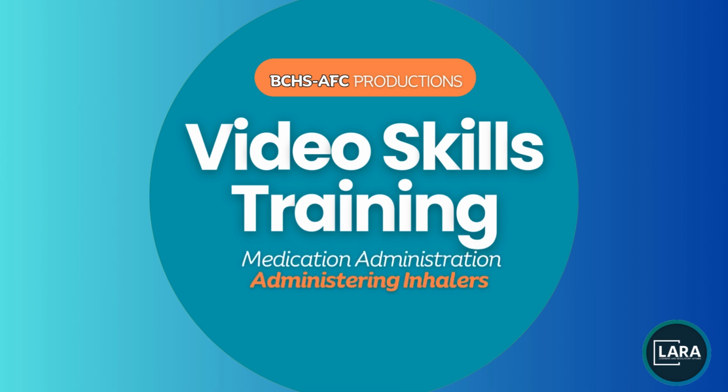Welcome, caregivers. In this video, we will discuss how to administer inhalers to residents.